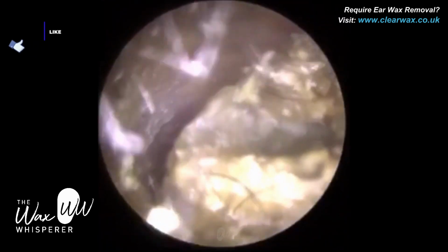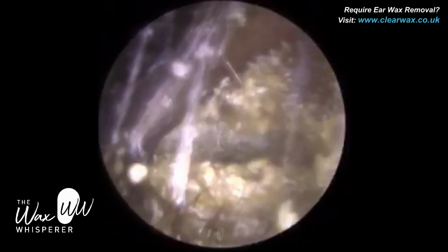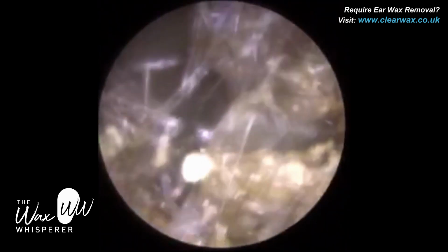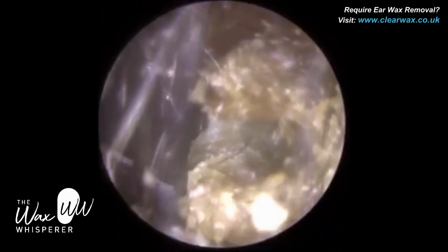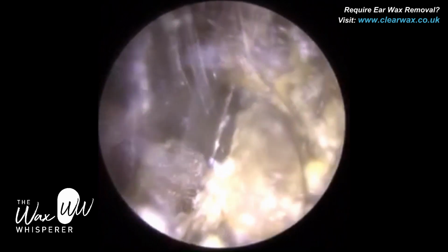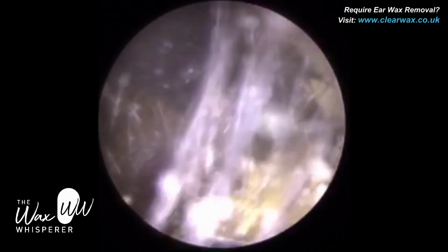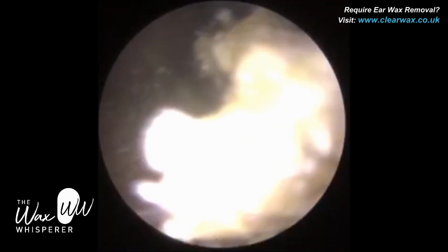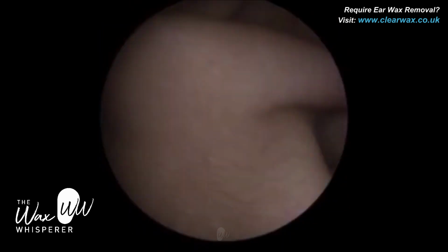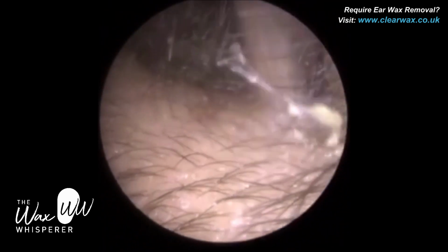I initially used an ear hook because there's a bit of an opening at the top. I inserted the ear hook into the main body of the wax, however it just dissected it. It didn't move it forward to extract it. So because I've created a bit more of a wider opening, because the wax is a bit soft, I've decided to now use a curette, also known as a Jobson horn. I managed to get a bit more wax out, however, there's still a significant amount of wax still in the ear, and it just didn't feel right.